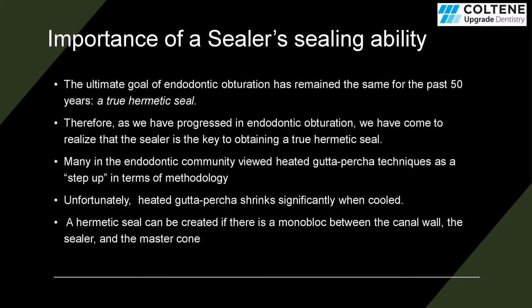Over the years, different types of sealers have been produced, starting with Hydron. That was a monoblock that was produced, and eventually it was a resin sealer and it was ultimately discarded. And since then we have come a long way, and today we have very magnificent sealers which kind of heal themselves, like bioceramic sealers and all of those. Today we'll see what GuttaFlow 2 has to offer and how it is very different from the types of sealers that we have in the market today.